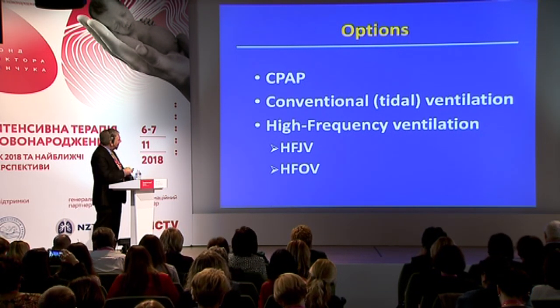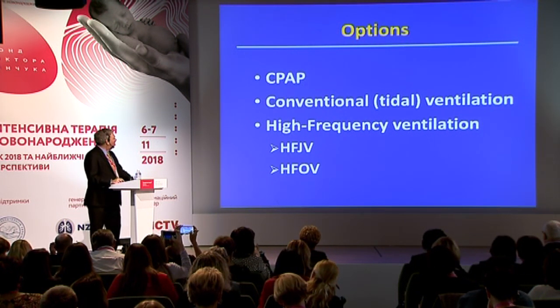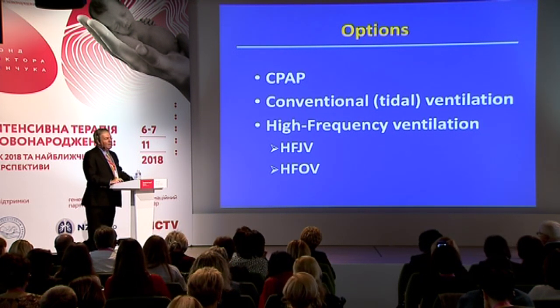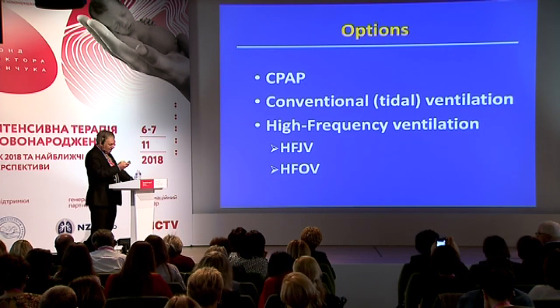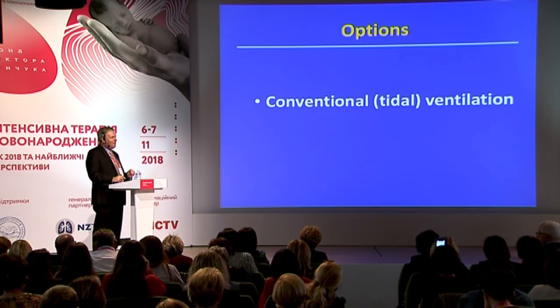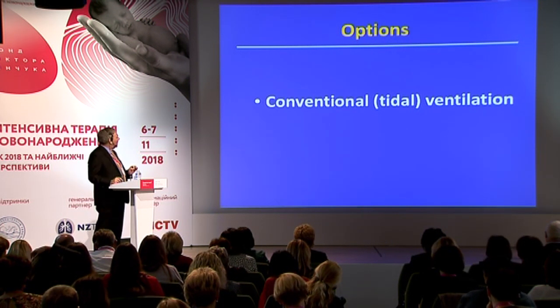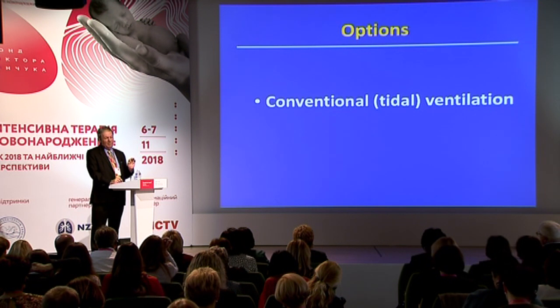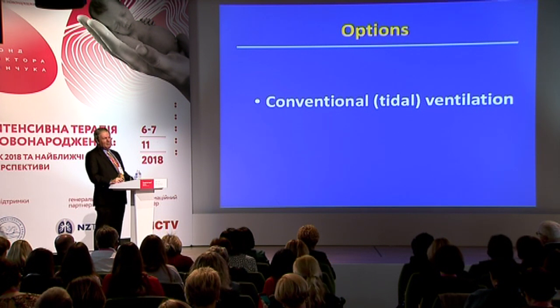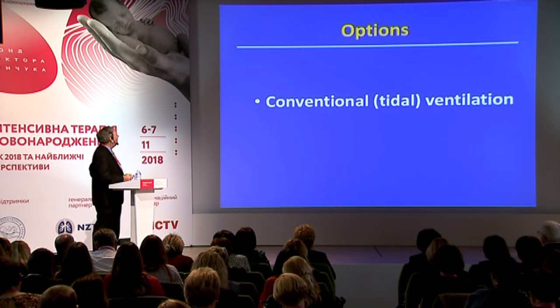And although there is a very large swing of the pendulum towards non-invasive ventilation, and in some places, very sick babies who are ultimately started on high-frequency ventilation, I'm just going to concentrate now on babies who have lung disease severe enough to warrant mechanical ventilation, and I'm going to address only conventional or tidal volume ventilation. I'd be happy to talk about continuous distending pressure or high frequency, but we would be here until the end of the week.